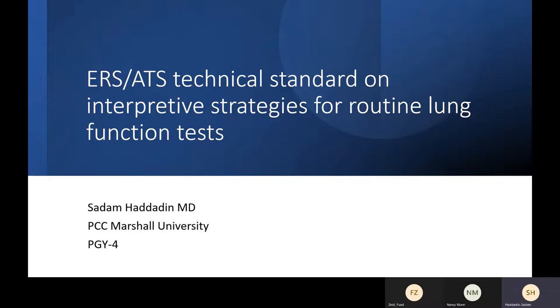Normalization versus improvement to meet the cut line. That's right. So reversibility means that after I give the bronchodilator, it came back to normal. Depends where you're starting from. That's right. Yes. But significant response means that it just met this point, but he did not go back to normal. Yeah. We have a question.